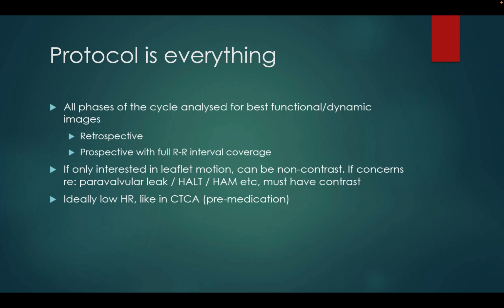The acquisition protocol is paramount, because prospective acquisition without the maximum radiation would lead to a repeat because of the metal artifacts. So you can do it retrospectively, which is the spiral CT, covering the entire cardiac cycle. The CT detects the QRS, and after the acquisition reconstructs the images according to your preference in cardiac phases, whether systole or diastole.